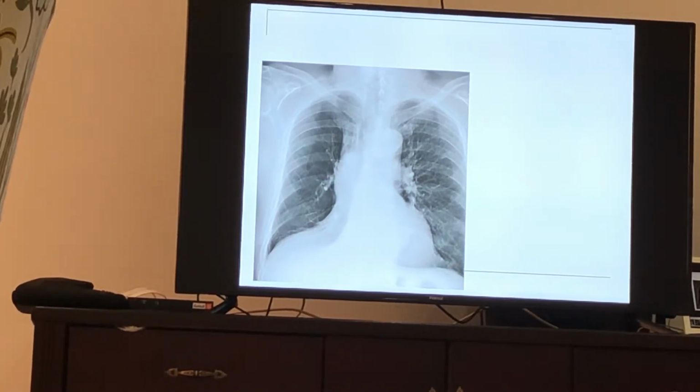It's going to get more difficult. Prominent aortic knuckle. Okay, which side? Right side. If you want to say anatomically, what's unusual? Right what?